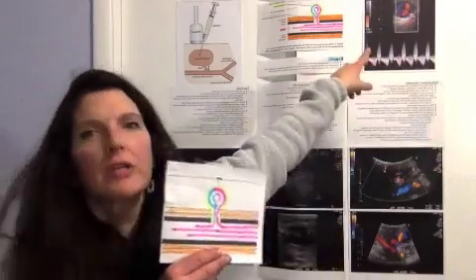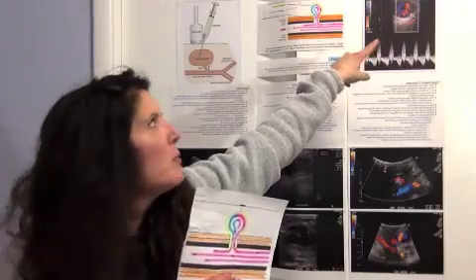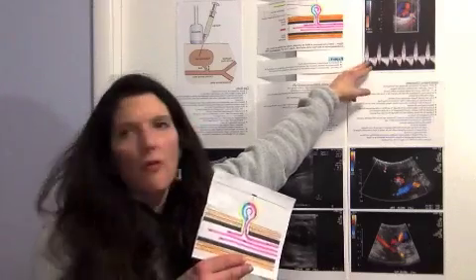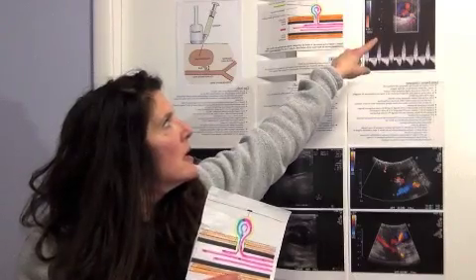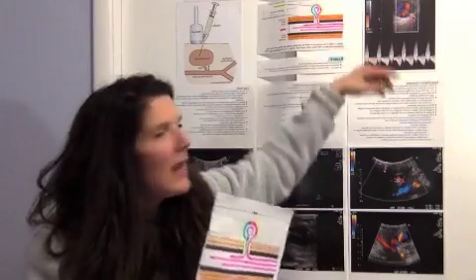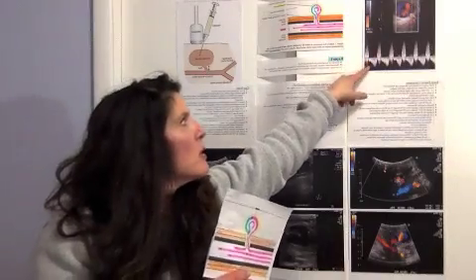And here's a demonstration up here that shows the yin-yang symbol in the lumen portion of the pseudoaneurysm, as well as a to and fro blood flow spectral waveform. And you can see the spectral Doppler is in the neck portion. Well, it's kind of hard to see, but it's in the neck portion of the pseudoaneurysm. So that would display this type of waveform pattern.